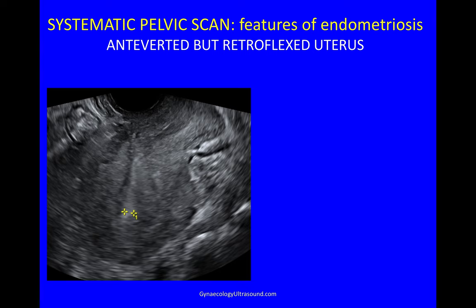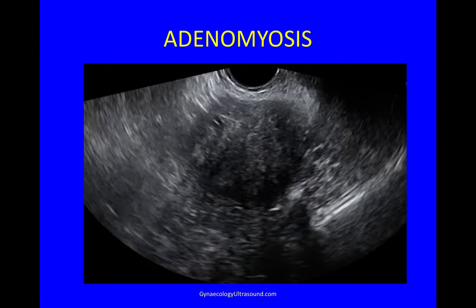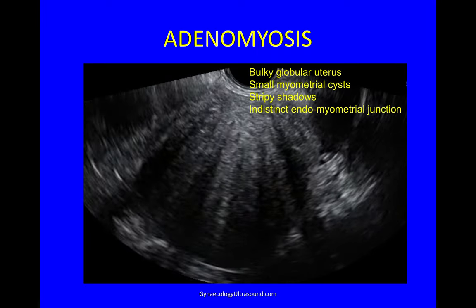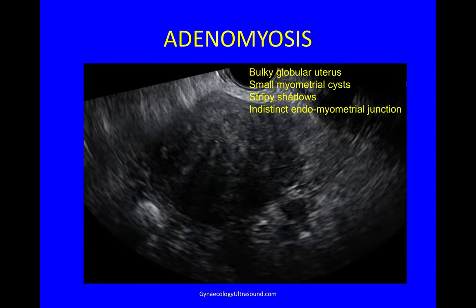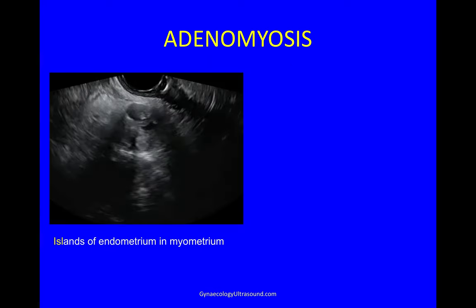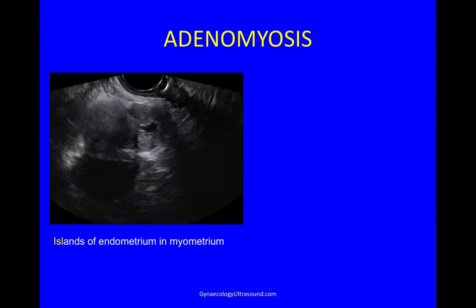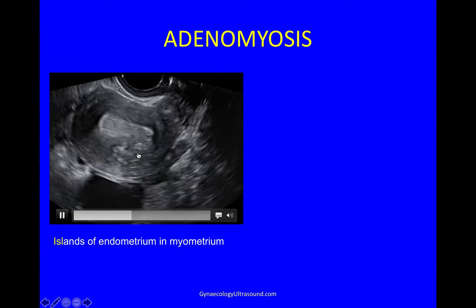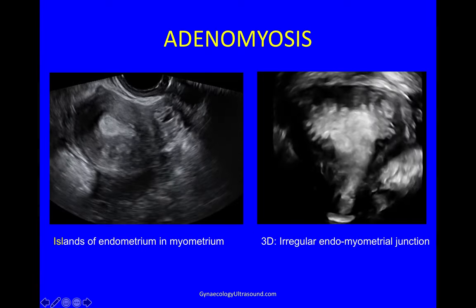We start with a systematic pelvic scan looking for features of endometriosis. If a uterus is anteverted but retroflexed, you've got to think about why it is being pulled backwards — it's usually because of adhesions. The other thing to look for is adenomyosis. You can see here features of diffuse adenomyosis causing a bulky globular uterus, small myometrial cysts, stripy shadows, and a very indistinct endomyometrial junction. It can look differently — you can have islands of endometrium in the myometrium, and if you do a 3D image you can see a very irregular endomyometrial junction.